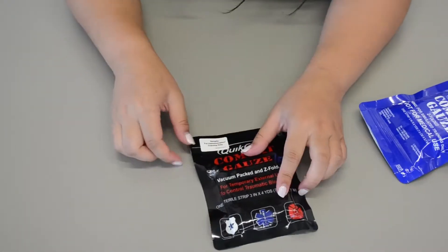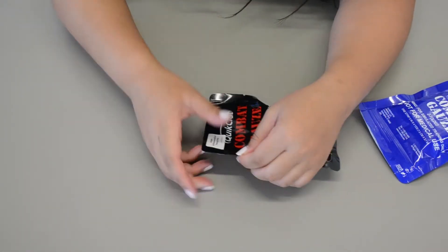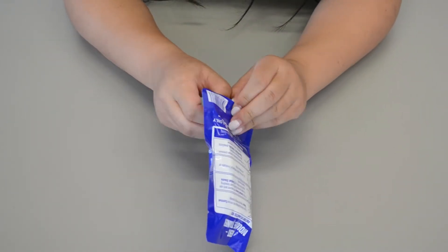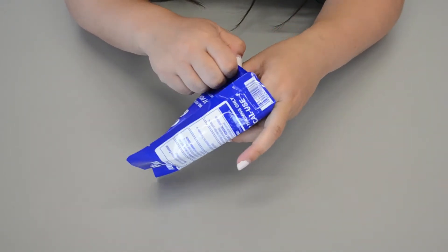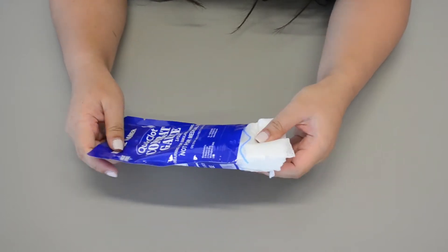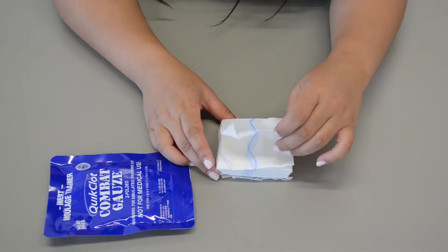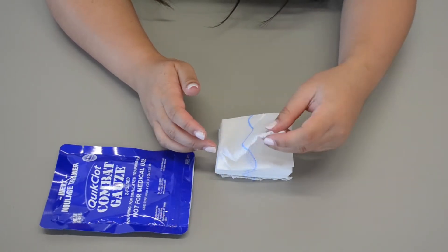So once you open up this one, you're just going to open it up like this and rip it open. We're going to open up the bottom, and the quick cloth — the combat gauze — comes in a Z-fold. Kind of like tissue boxes, if you pull it up, it's just going to unravel on itself.